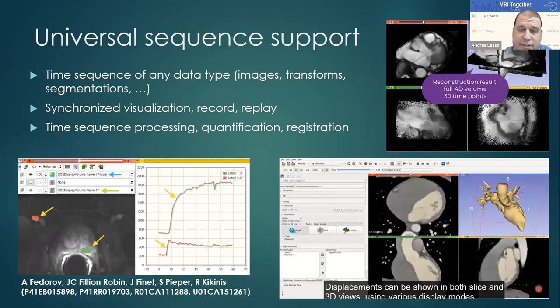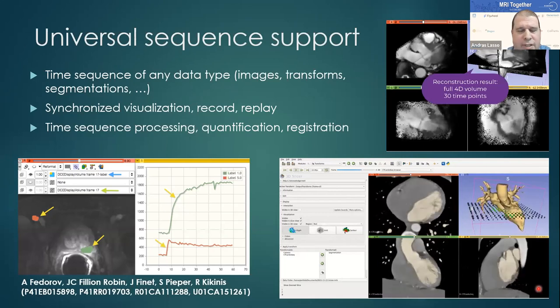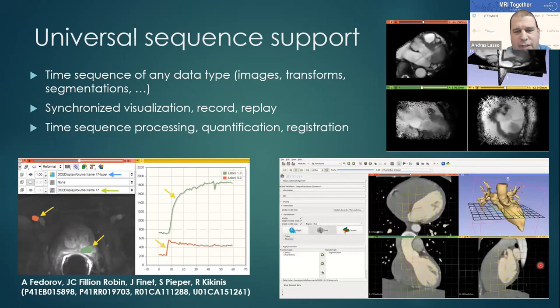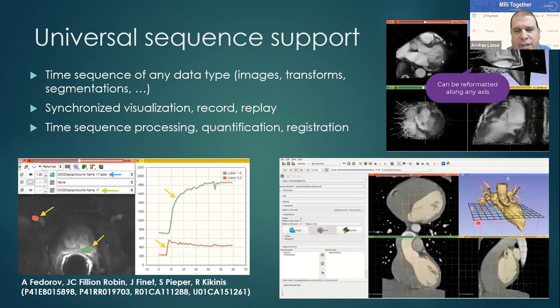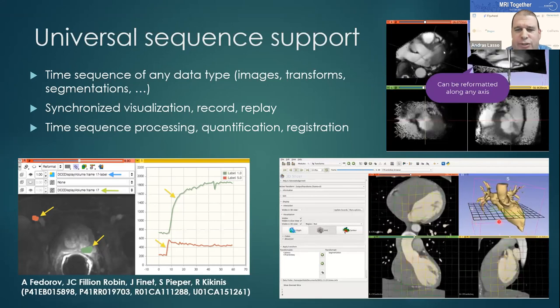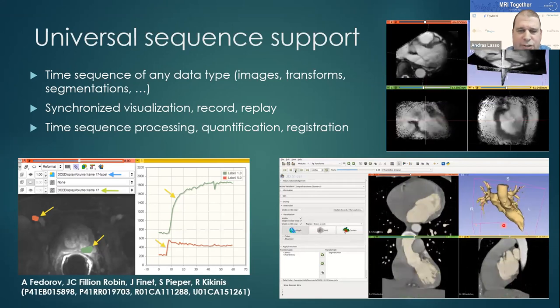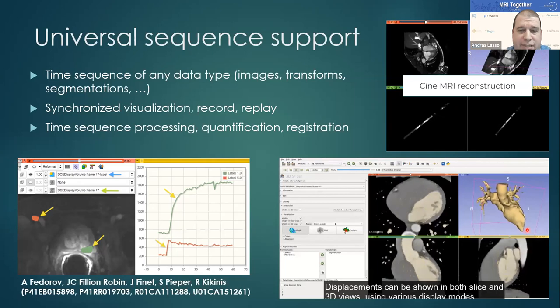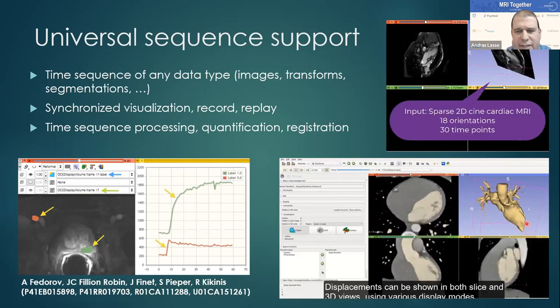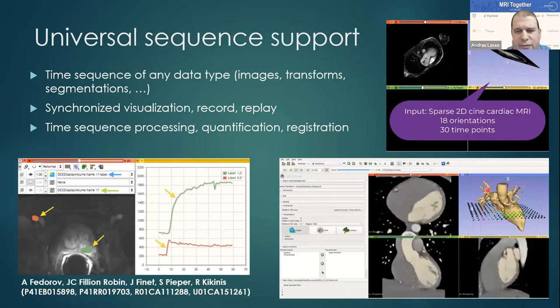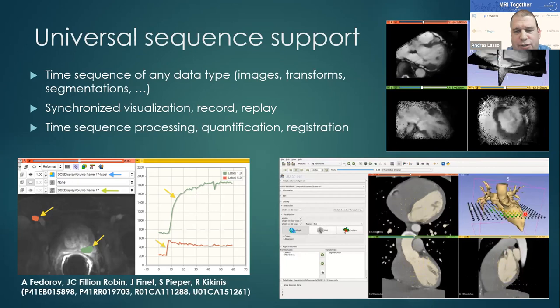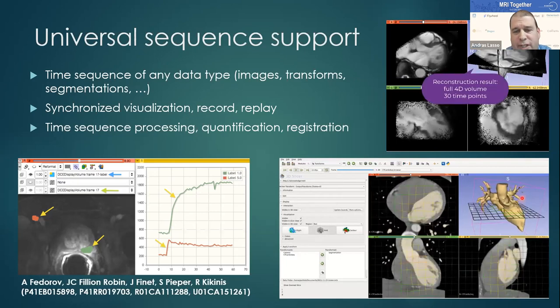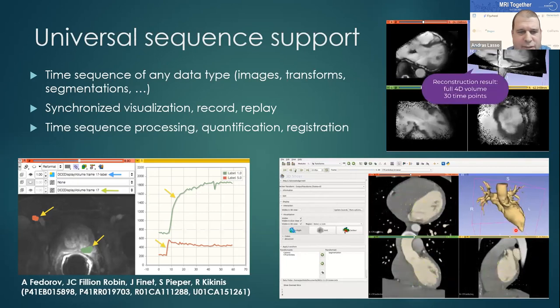Another capability involves registering an image sequence to determine a displacement field and visualizing that as a transform. You can then apply it to a segmentation — segmenting only a single image slice — and then applying the displacement field to the segmentation to get a four-dimensional segmentation.